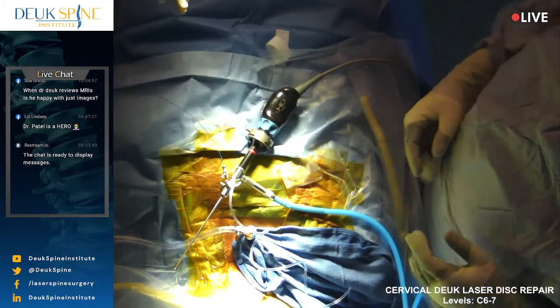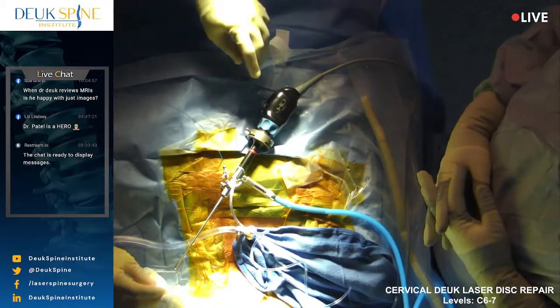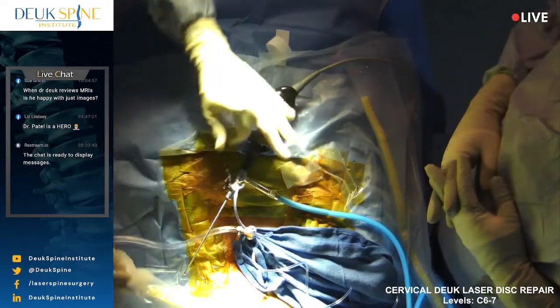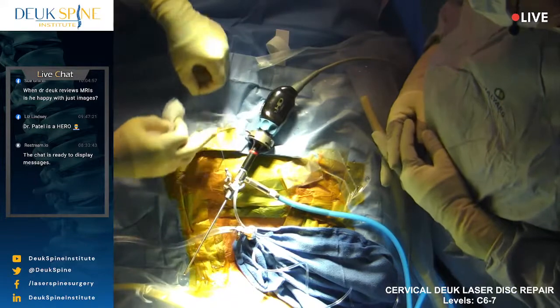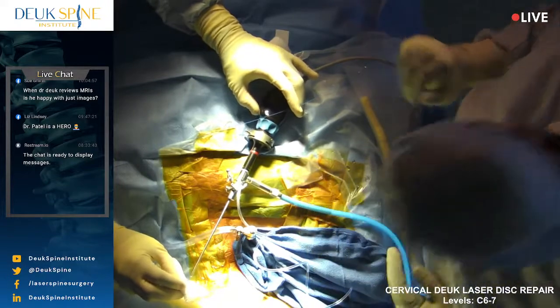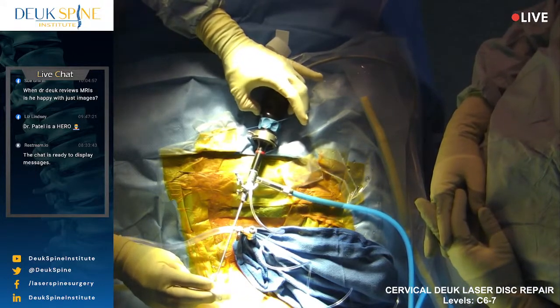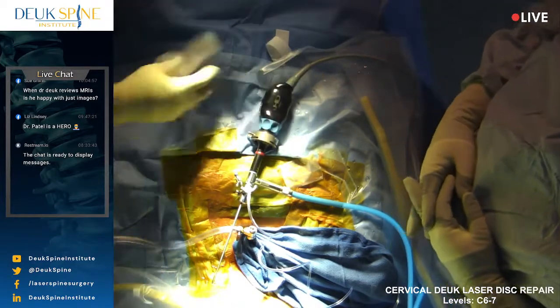I didn't know if we were having a problem with the hardware. Camera is completely on. There you go. That's perfect. All right, so you're gonna have to white balance. Go ahead, but you don't want the red light from the laser. Turn the targeting beam off on the laser. Do you know how to do that? If you don't know how to do it, don't do it. There it goes. It's off. Oh, no, it's on. It's off. Keep it off. Wait, is it off? I got it in my hand. No problem. Yeah, you just don't want red light during a white balance. Monica? All right, good. Thank you. Thank you very much.